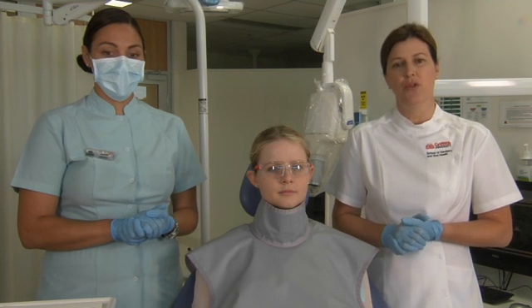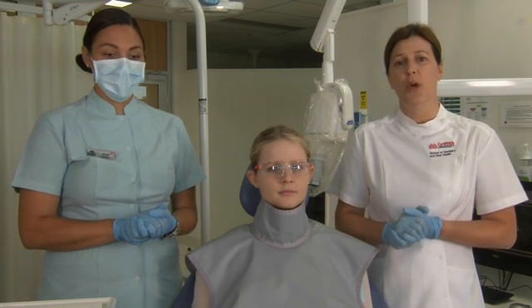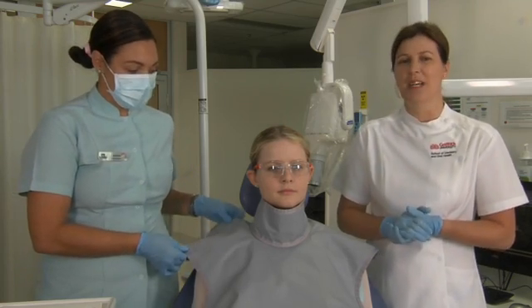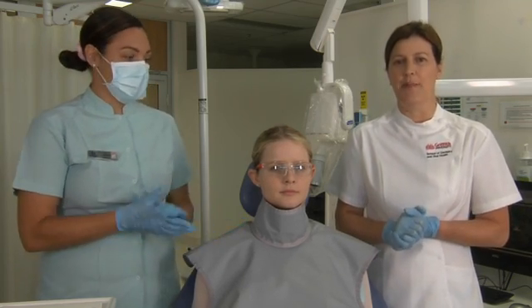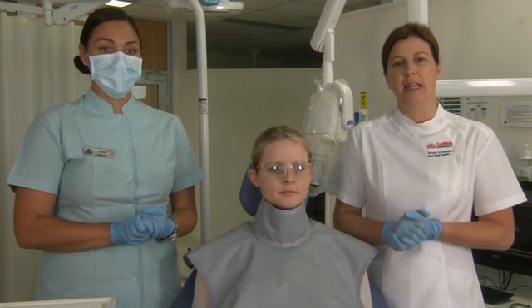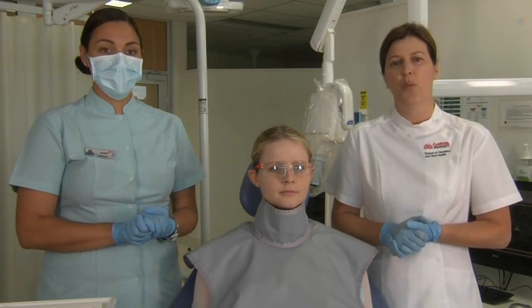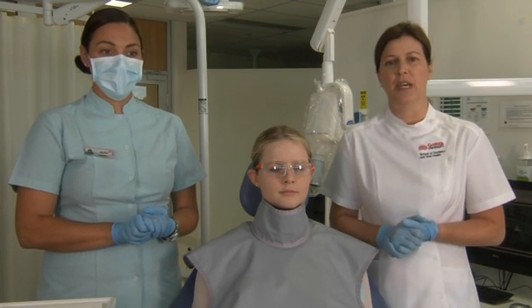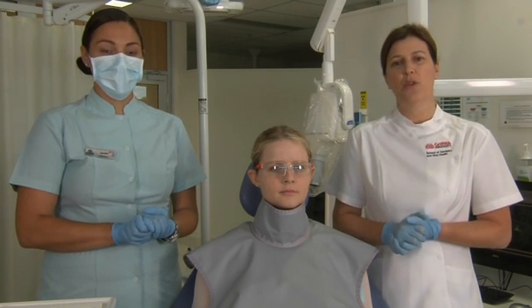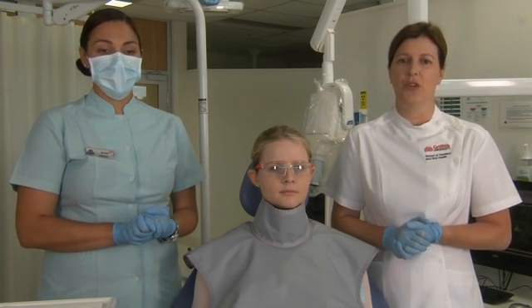Also, for children and women of childbearing age, we always like to place a lead apron over the patient, and you'll notice that Jamel has already placed the lead apron on our patient today. It's always prudent to ask women if they're pregnant. If your patient is pregnant, we try to defer taking the x-rays until after the baby is born, or if that's not practical, defer until after the first trimester.